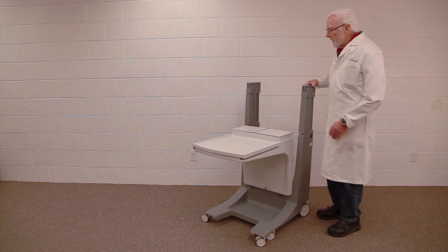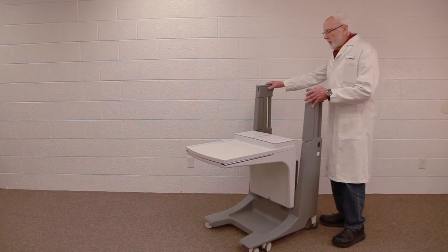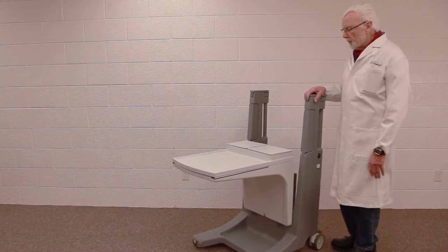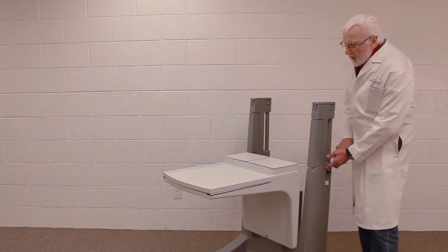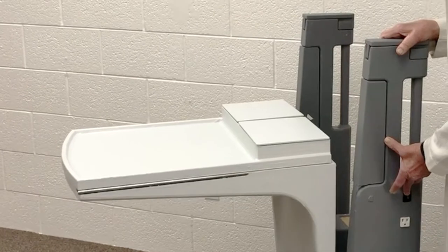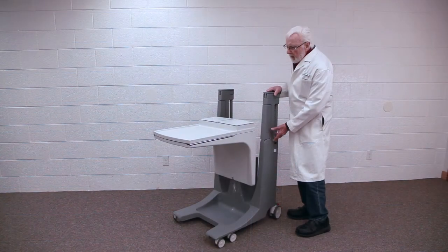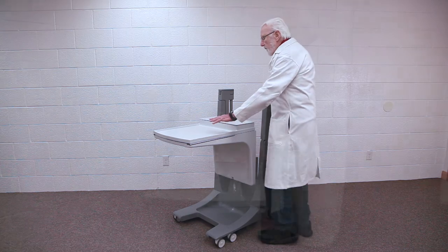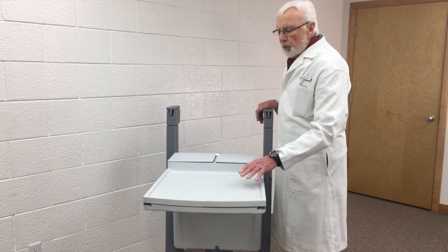So this is an overbed table — that should be fairly obvious. It has several features that are a little bit different from the typical hospital overbed table. It goes up and down, and in this case it's a rechargeable battery that operates an actuator that can raise the table up to whatever height is desired.